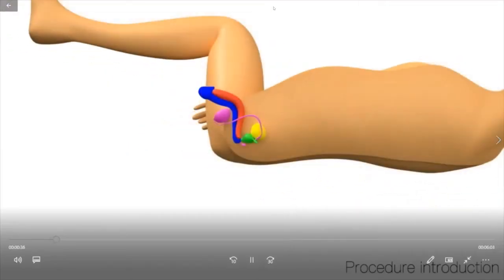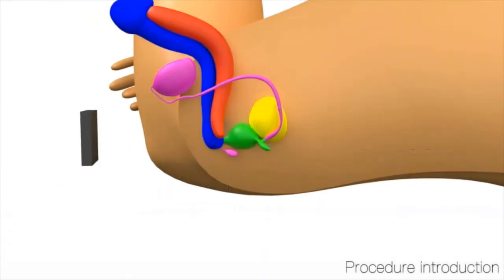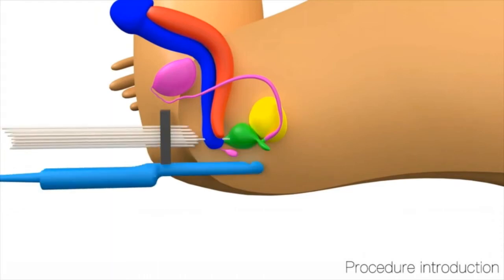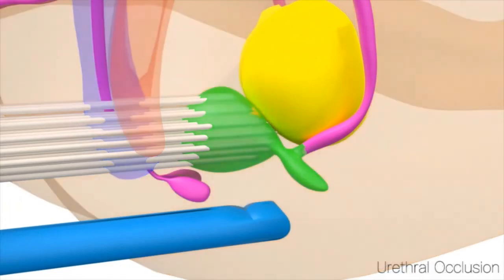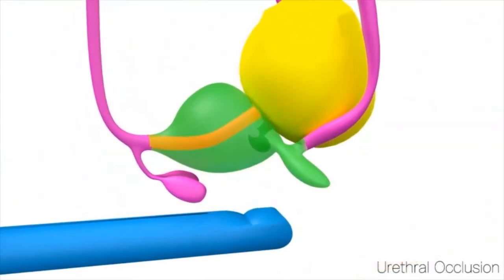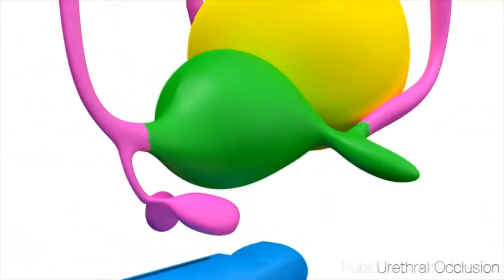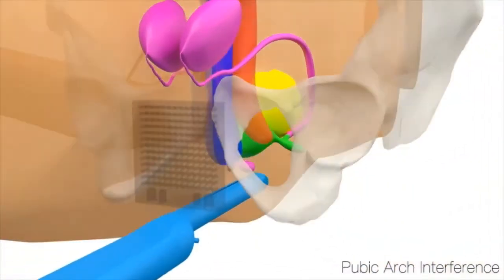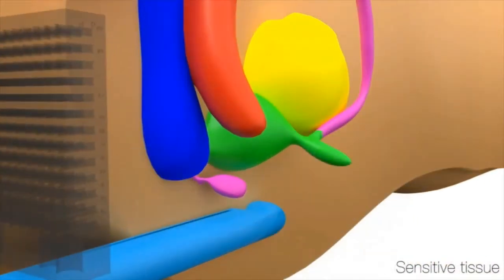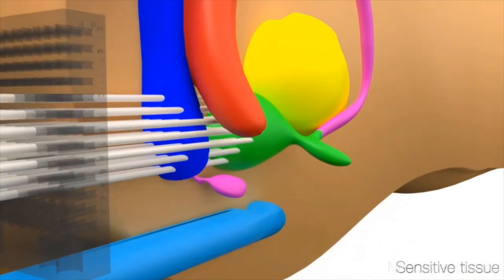Here the conventional LDR procedure is shown. The prostate in green and important structures around it are visualized. The needle template and transrectal ultrasound probe are positioned and 15 to 25 straight needles are placed in the prostate, leaving behind permanent seeds. However, some areas of the prostate cannot be reached because they are occluded by the urethra or the pubic arch. This may cause suboptimal dose distribution. Next to this, with straight needles, trajectory control may be lacking and sensitive tissues cannot be avoided.